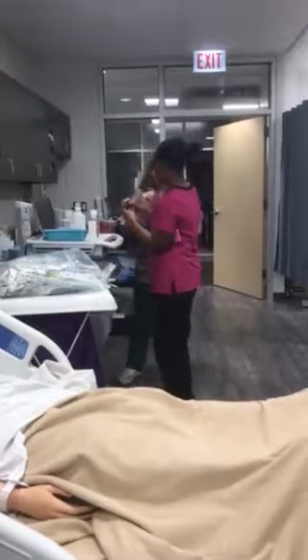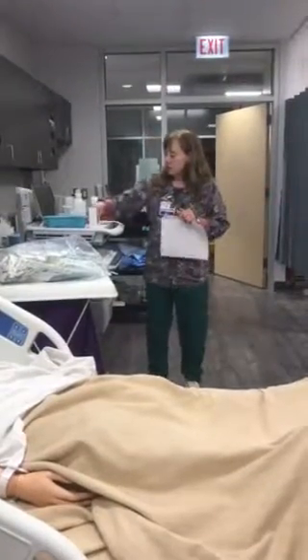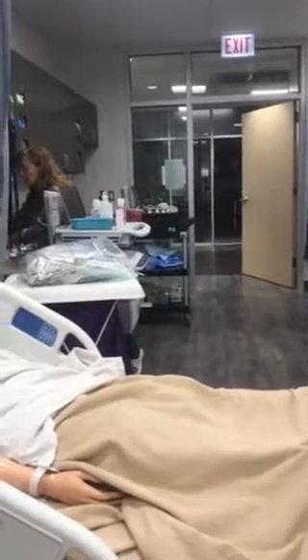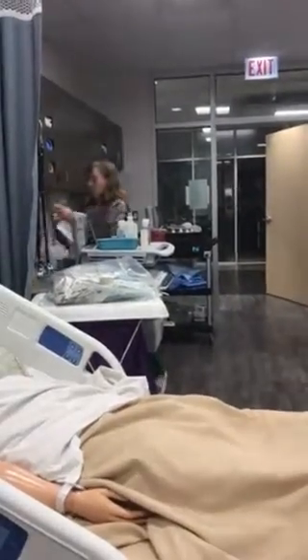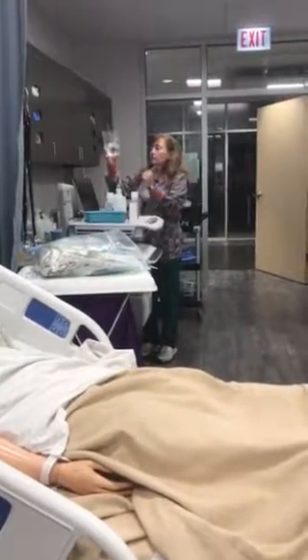So then we would take our prepared label and go ahead and stick it on the cup. Okay. Awesome. So I would have brought in some free water, or I would get some free water. Again, you need to make sure you tally everything up on your I&O. And we're just giving them free water out of the sink? Yeah.